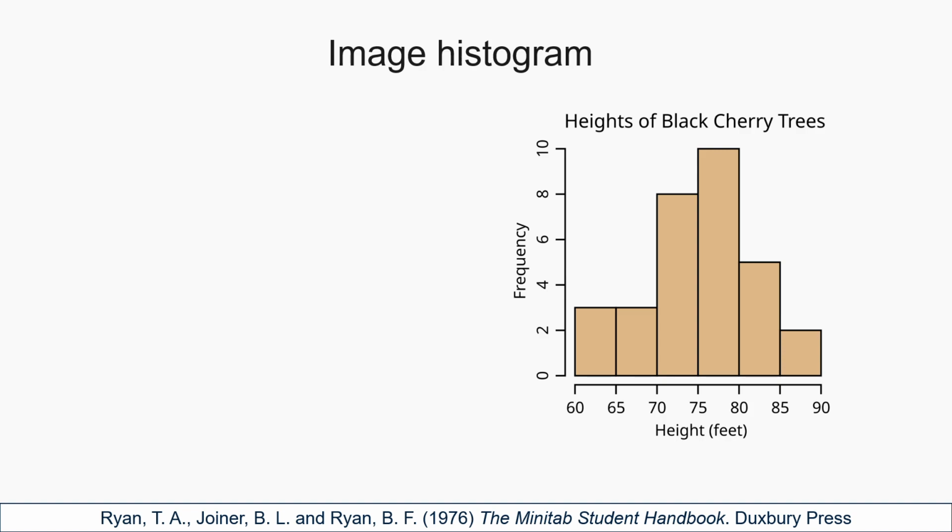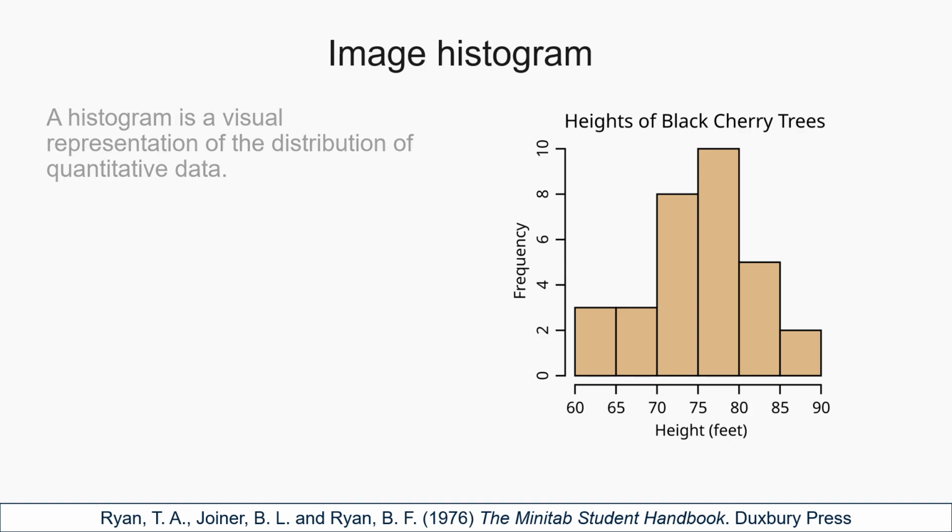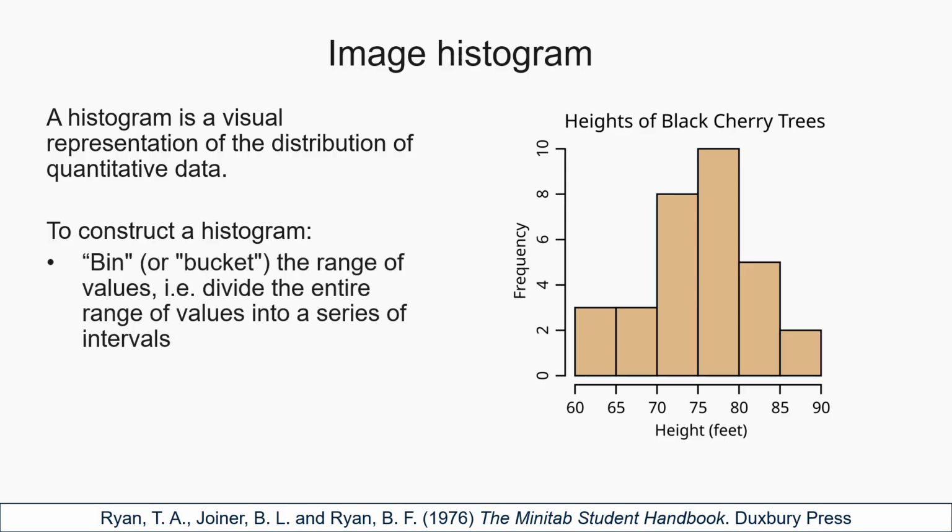A histogram is a graphical representation of quantitative data. To create a histogram, pixel values are grouped into intervals called bins. We then count how many pixels fall into each bin. The resulting graph helps us visualize the overall distribution of intensities within the image. Histograms are particularly useful for assessing contrast, identifying background signal, and detecting saturation or clipping. However, remember that they summarize value distributions and do not tell us where specific pixels are located.